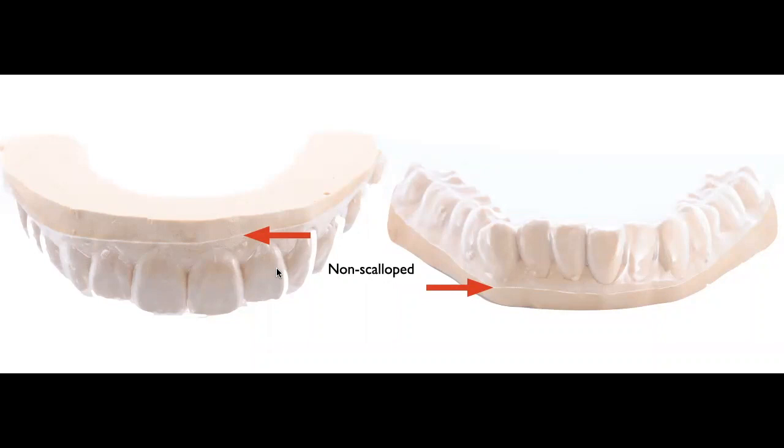And why is that good? This is good because you will see that many of your patients will achieve the color that they're looking for, a very high value as an end result, but they will still have product remaining that they can use in the future for just some retouches. This product is good refrigerated for maybe 2 years, so they will be able to use it 6 months, 8 months down the road just to retouch their bleaching and get the whiteness, the light, back into their teeth. So if you don't have any reservoirs, there's a lot less product that the patient is going to need. You can actually control that.